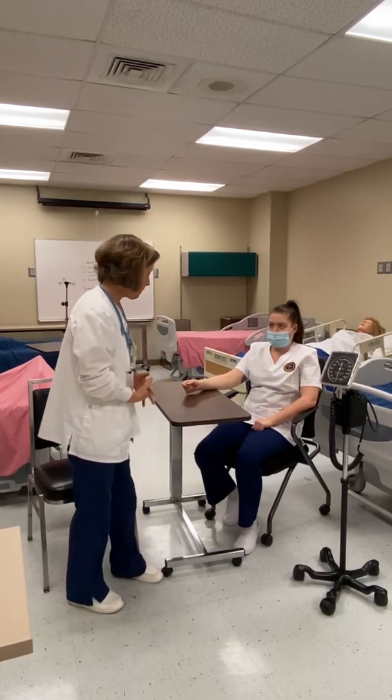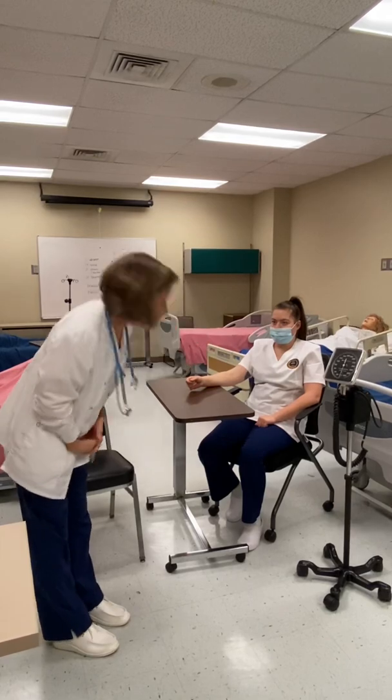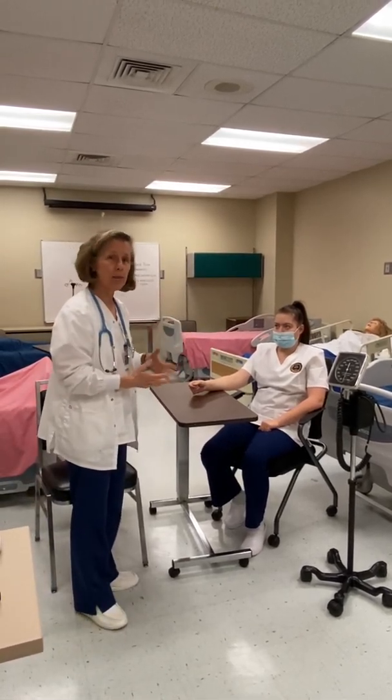Victoria is going to be my patient today. I'm going to make sure that her legs are not crossed, because if your legs are crossed that can give us a false high blood pressure reading.